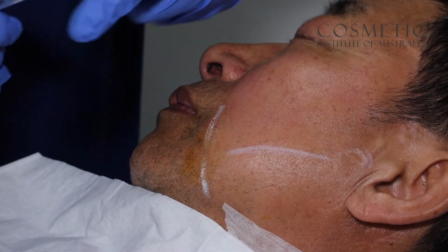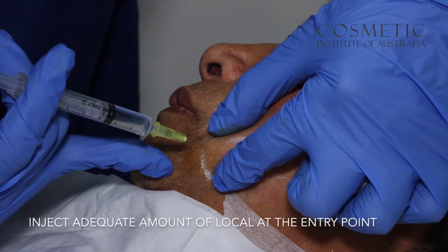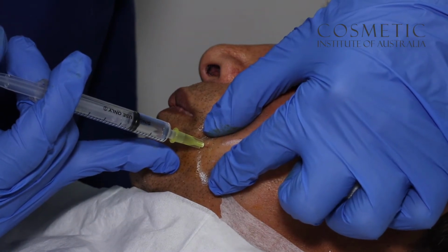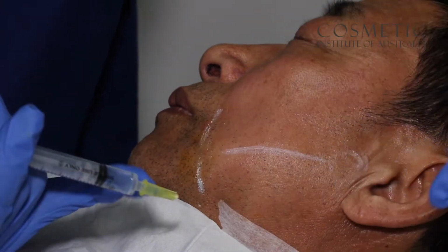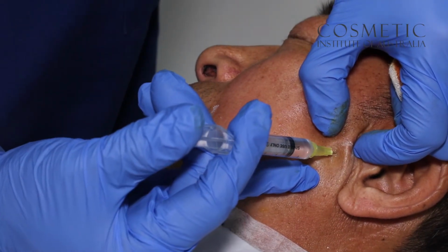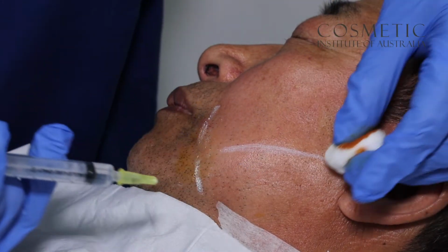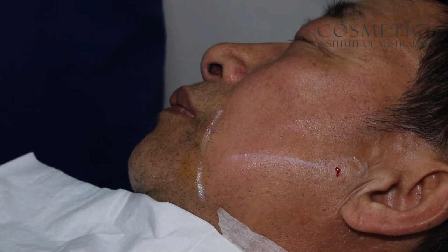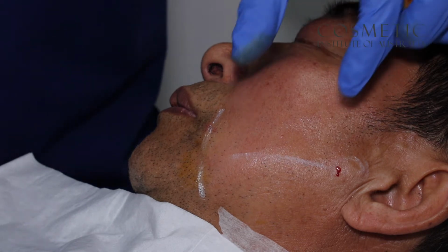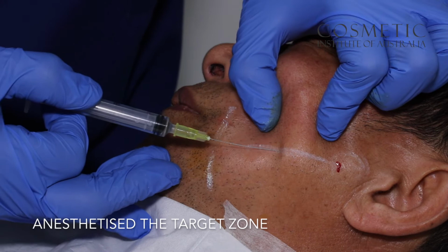Thirdly, local anaesthetic is administered for the procedure. Inject a small amount of local anaesthetic at the entry point. Also, inject a small amount of local anaesthetic over the zygoma if that is the end zone. Take note that this area of skin is quite sensitive. Lastly, administer a line of anaesthetic along where the thread will be inserted.